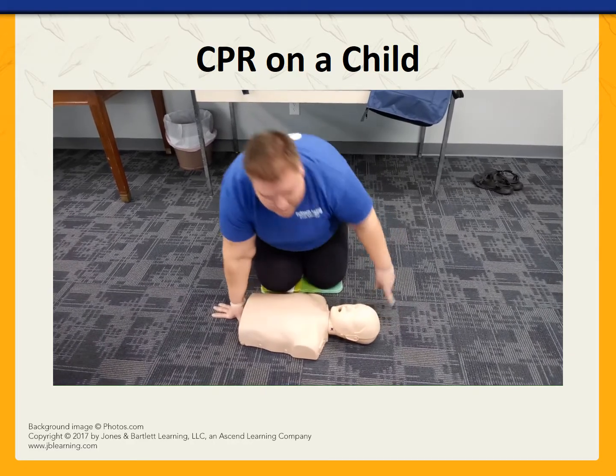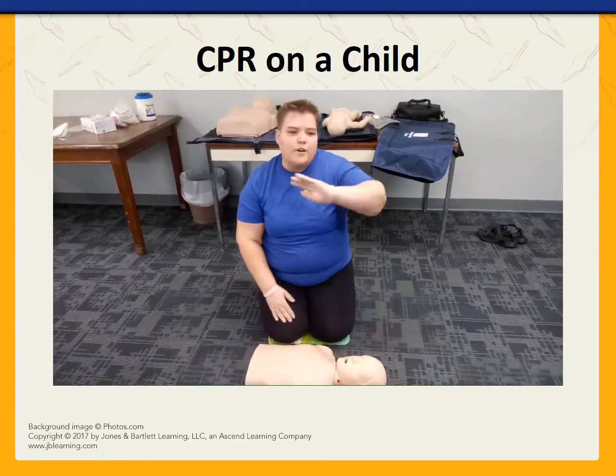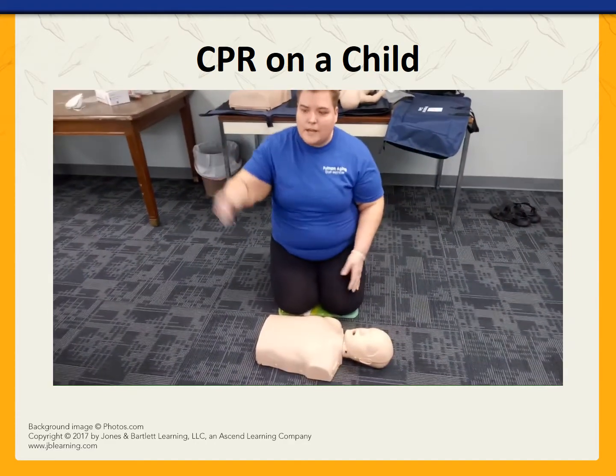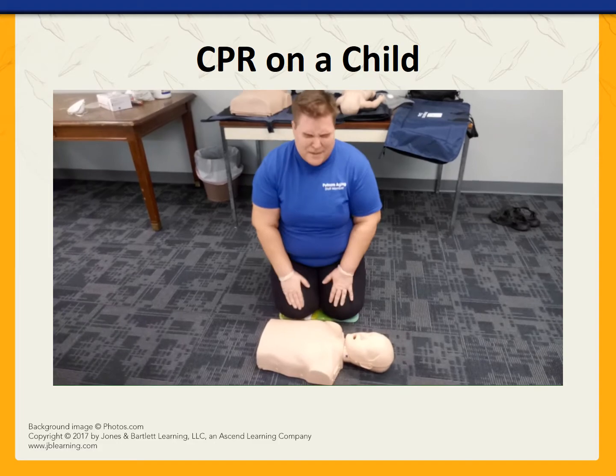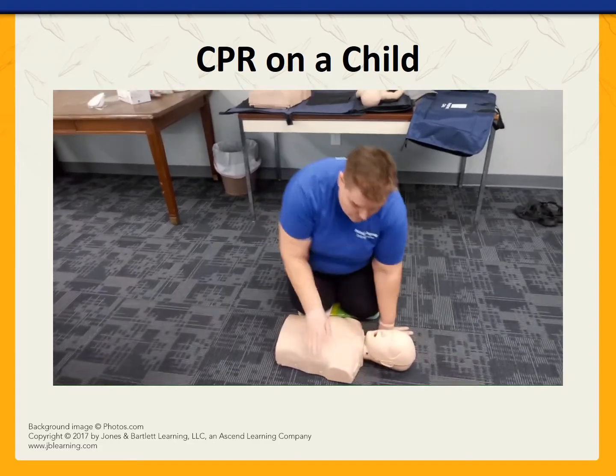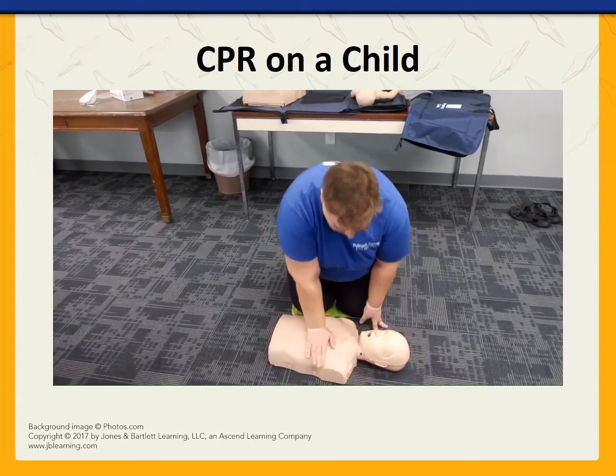It is not. So I'm going to go, hey, you in the plaid shirt, go find an AED and bring it back. And you in the blue shirt, go call 911 and get EMS on the way to help. And then I'm going to go straight into my compressions with one hand.